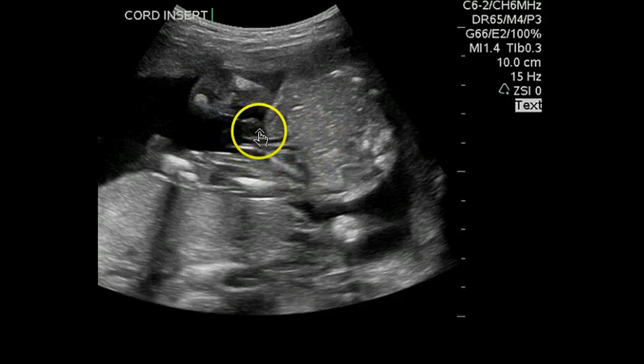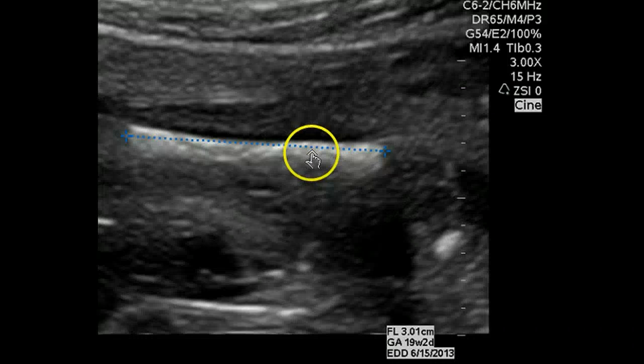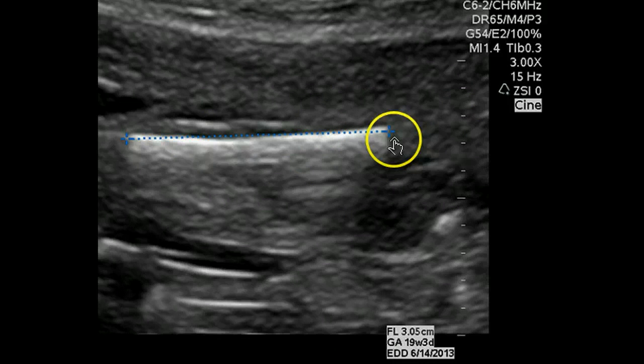The cord insertion, we're not seeing any definite abnormality. I think this is part of the cord. I don't think there's anything coming out there. And we'll pass that. The femur length, I like the way she did it, not including this femoral point, so-called femoral point here.